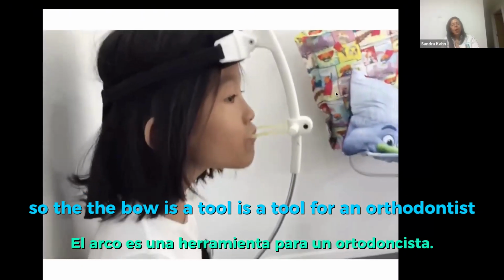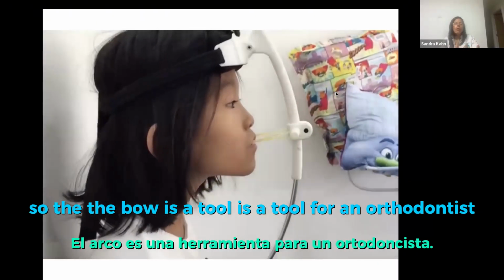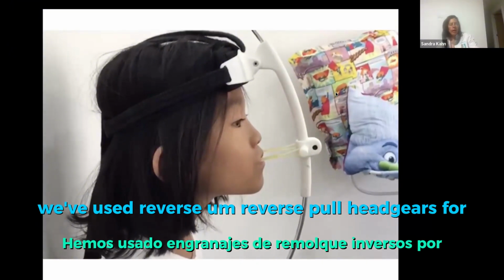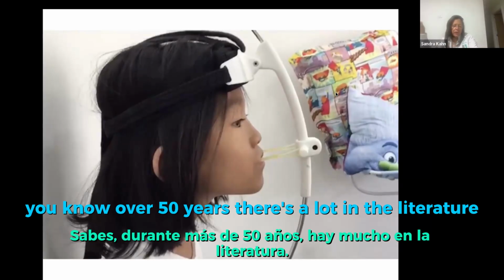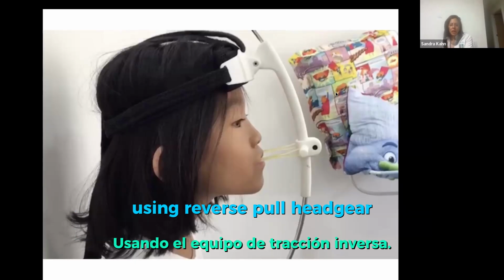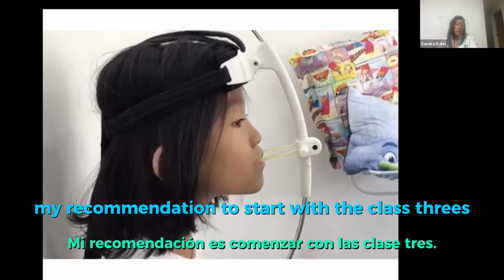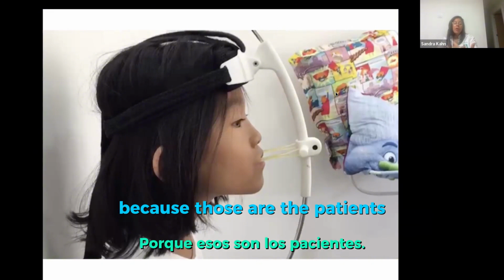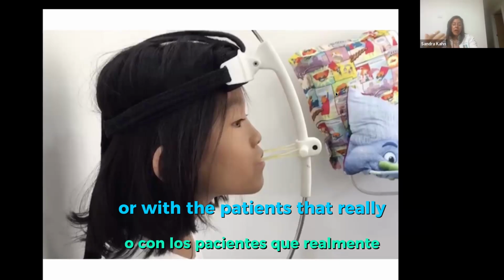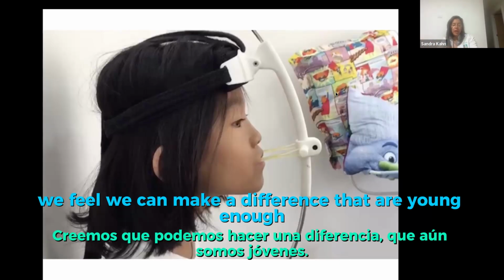Okay, so the bow is a tool for an orthodontist that knows what they're doing. We've used reverse pull headgears for over 50 years. There's a lot in the literature. So it is a tool for an orthodontist that is comfortable using reverse pull headgear. It's my recommendation to start with the class 3s, because those are the patients that will do whatever it takes, or with patients that we feel we can make a difference, that are young enough.